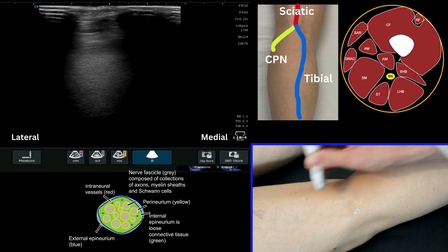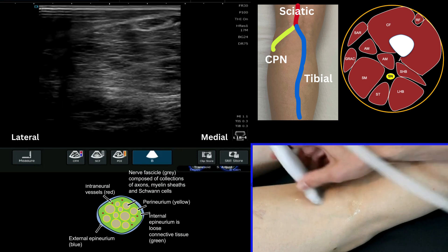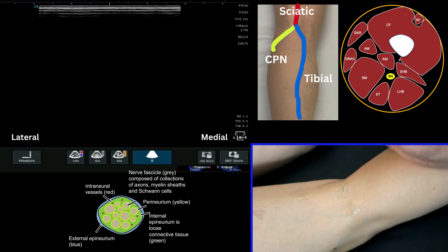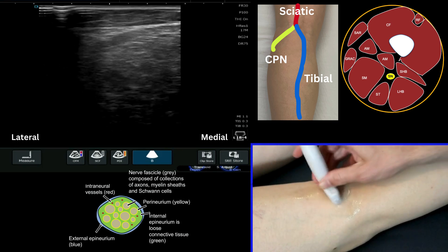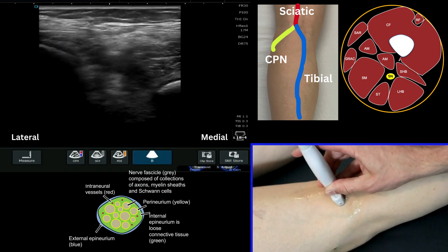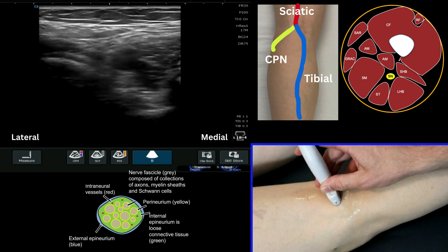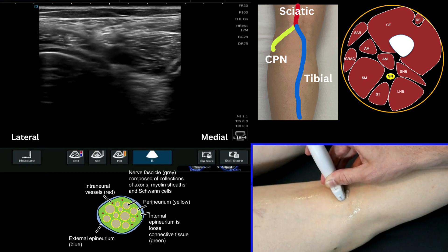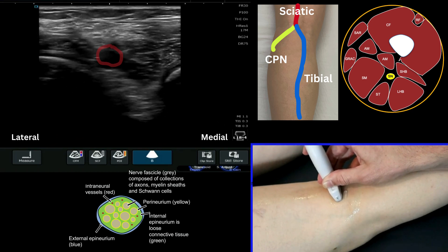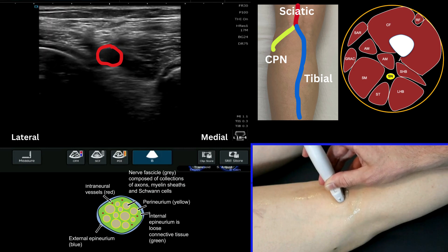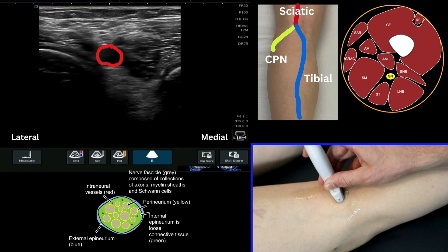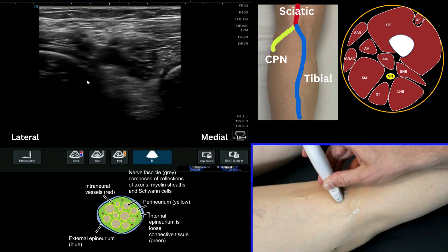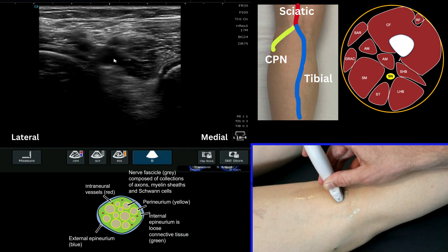This is a tutorial on how to look for the sciatic nerve in the popliteal fossa. The easiest way to find this structure is to initially find the popliteal artery by placing your probe on the popliteal fossa. You'll see the artery in the centre of the screen — I'll use my cursor here just to show you the location of the artery.